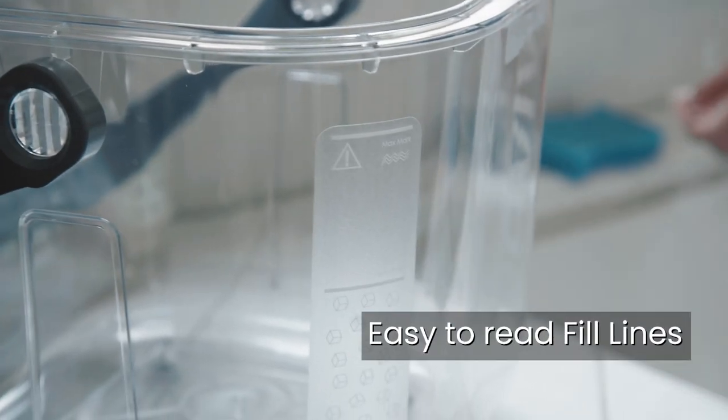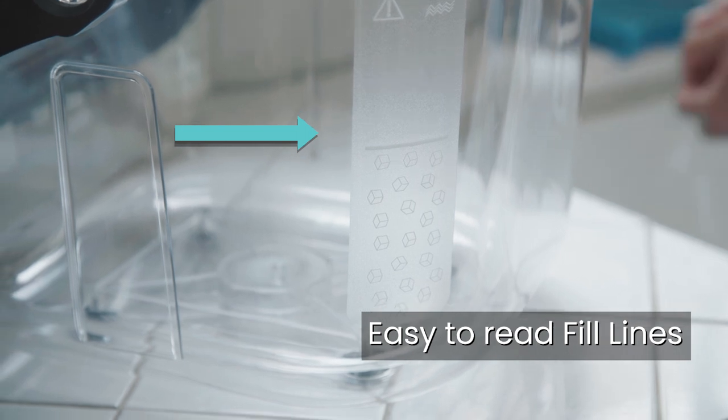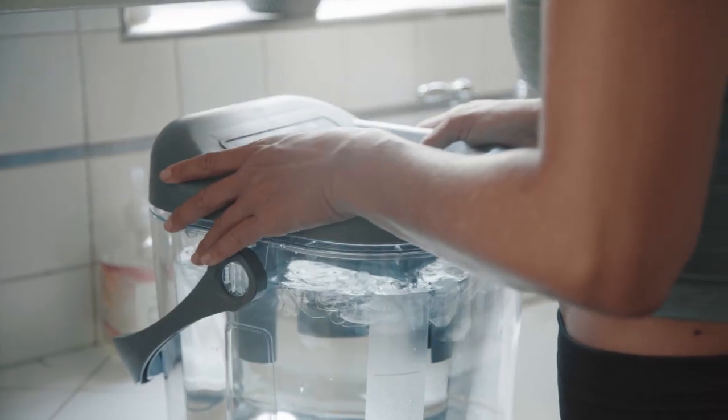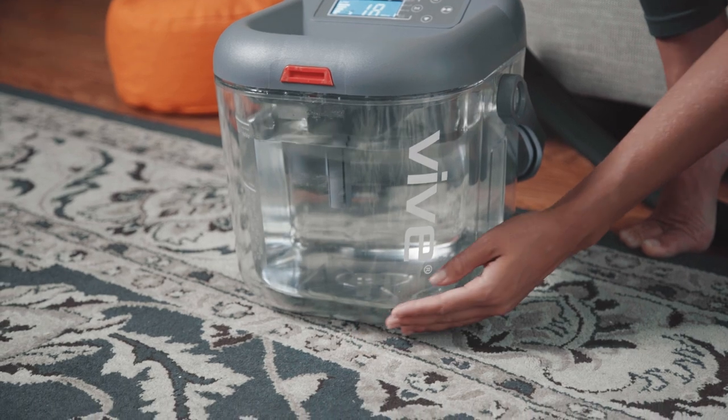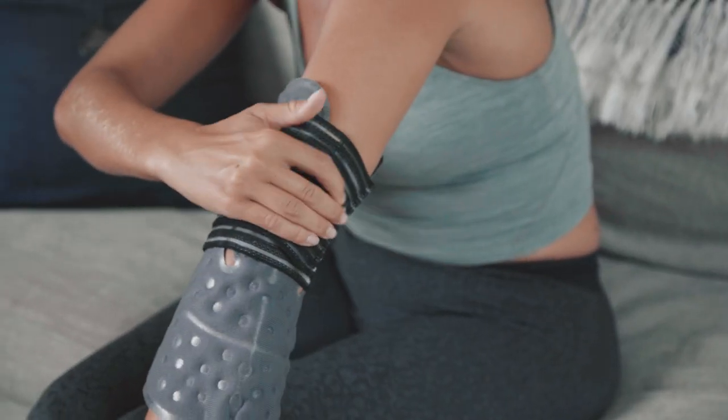The Ice Therapy Machine also includes convenient, easy-to-read fill lines to help guide you with setup and features a leak-proof lid system. The base is durable for use on any surface, and three adjustable straps ensure the pad won't slip or slide.